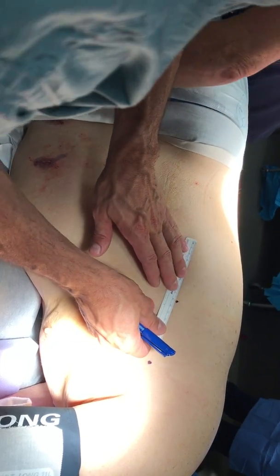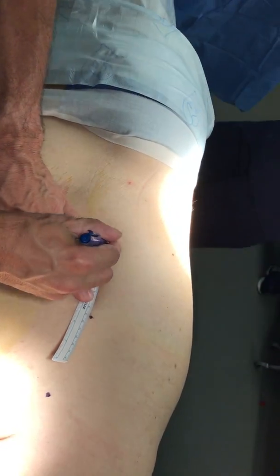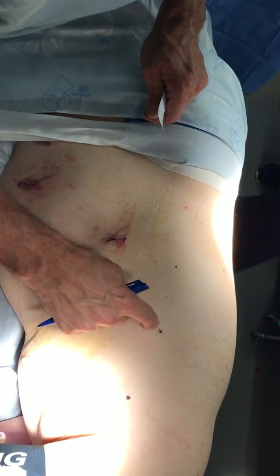Eight. See the little bit of an angle? That's maybe too much of an angle. Eight. And then here's your triangle.